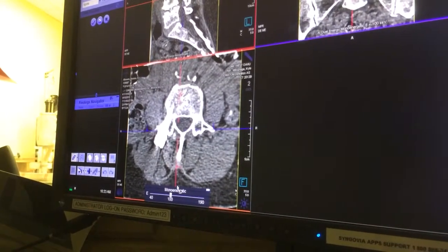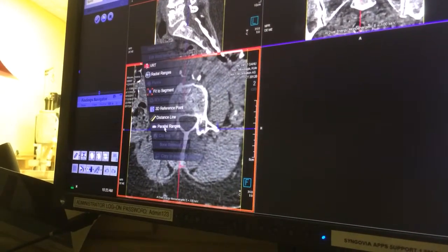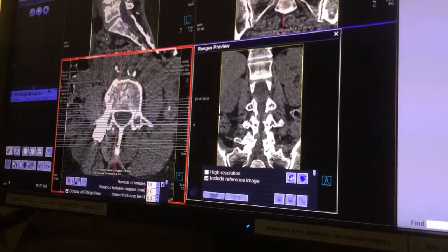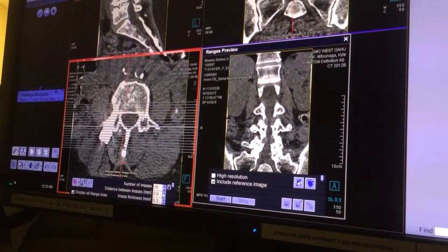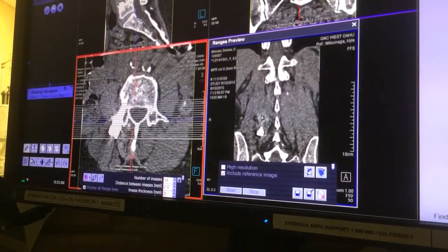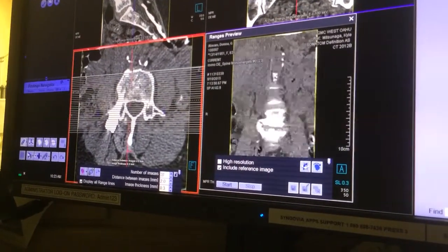Now that I've done that, I'm ready to do my coronals and sagittals. So let's right-click and click on Parallel Ranges. As soon as you do that, you get your nice coronal there. I just want to make sure I don't cut anything off, so I move it out. We're usually doing two-by-twos on these — come down here and just put two there. You'll want to save that. Now we're ready to go.